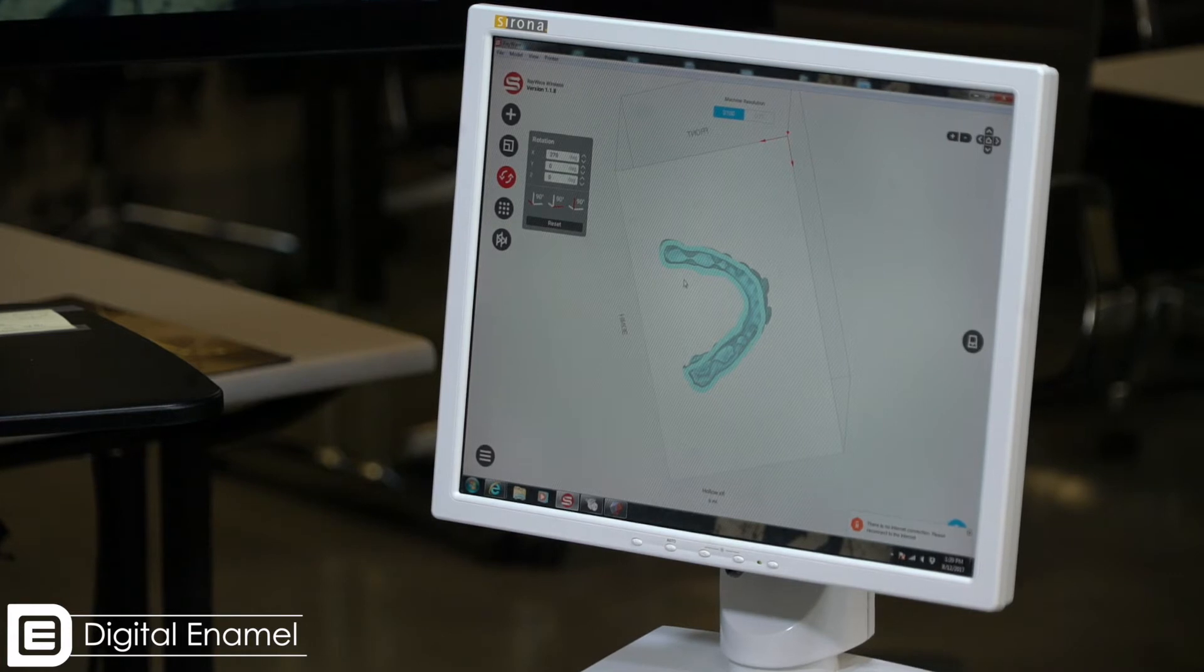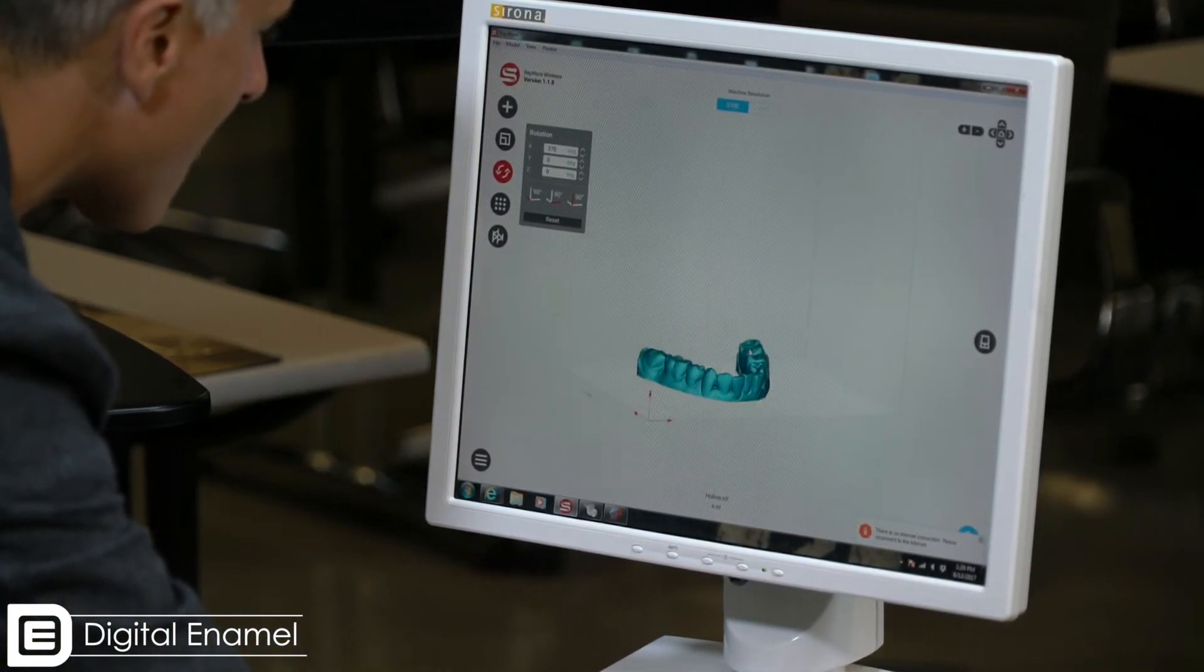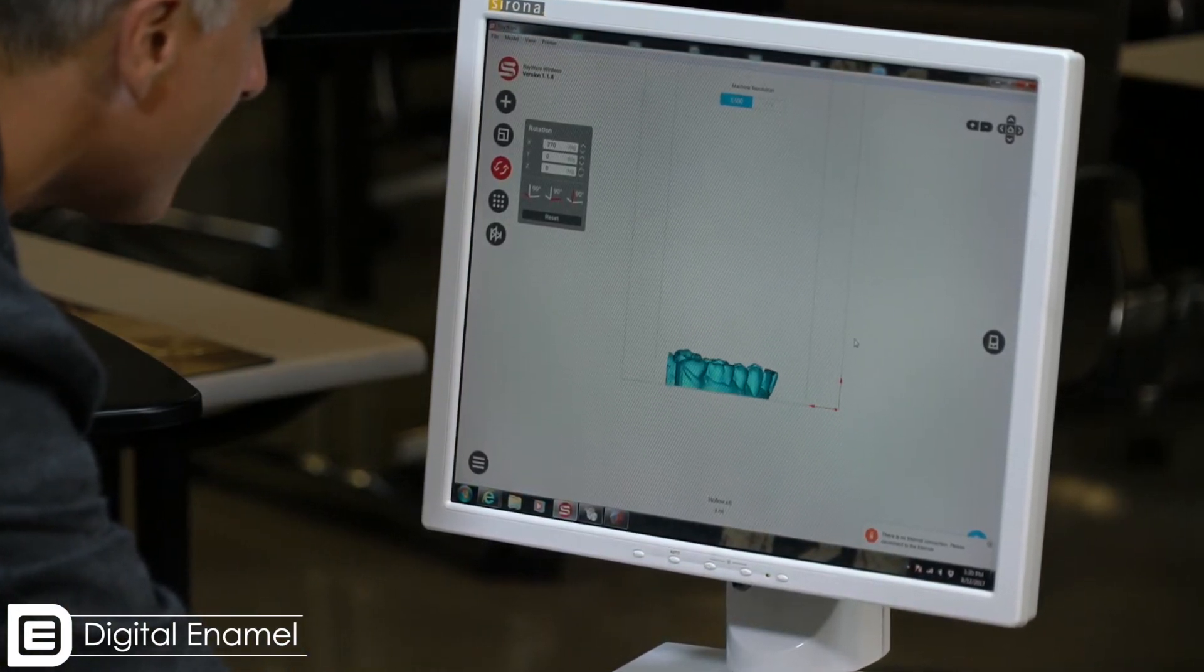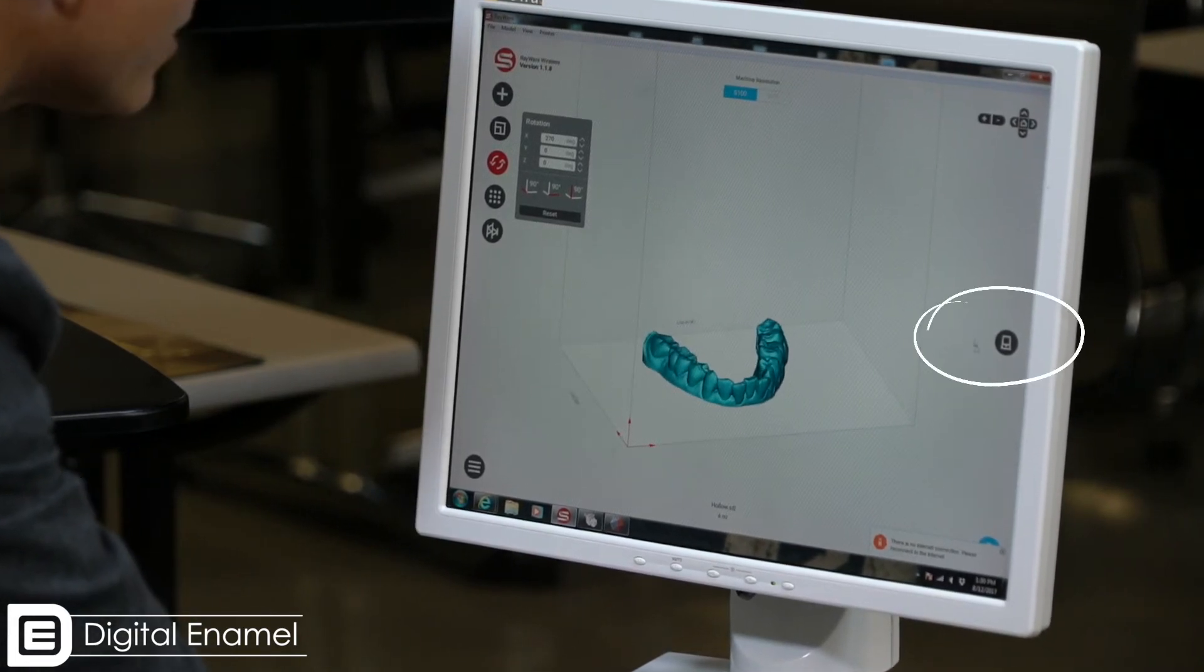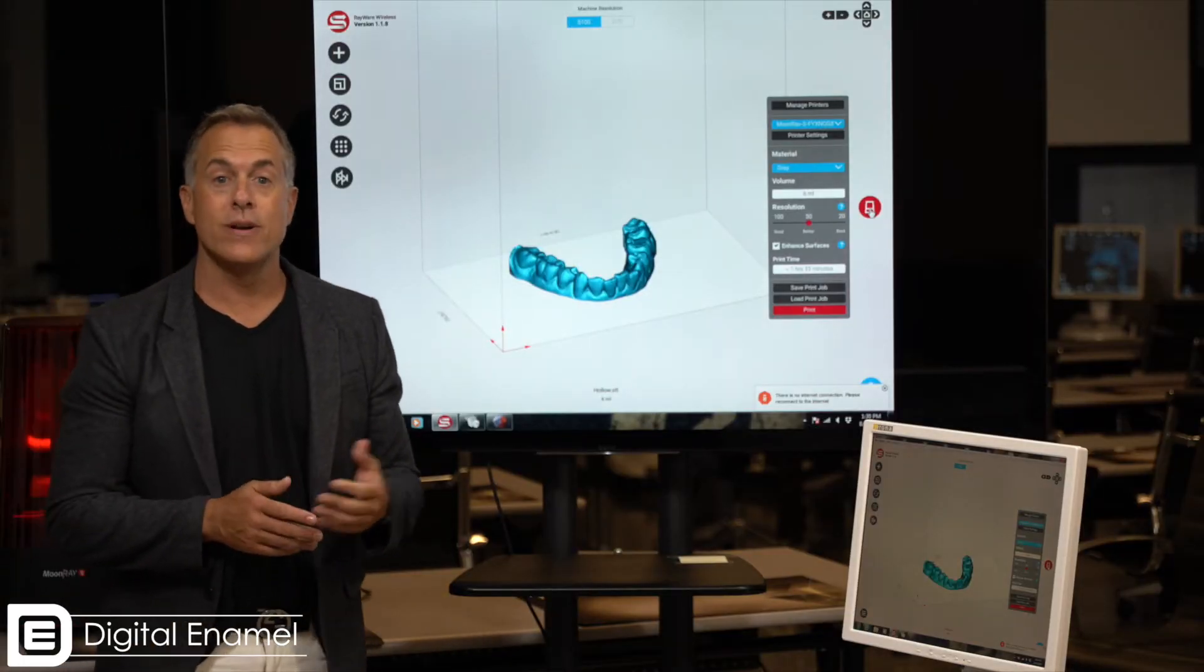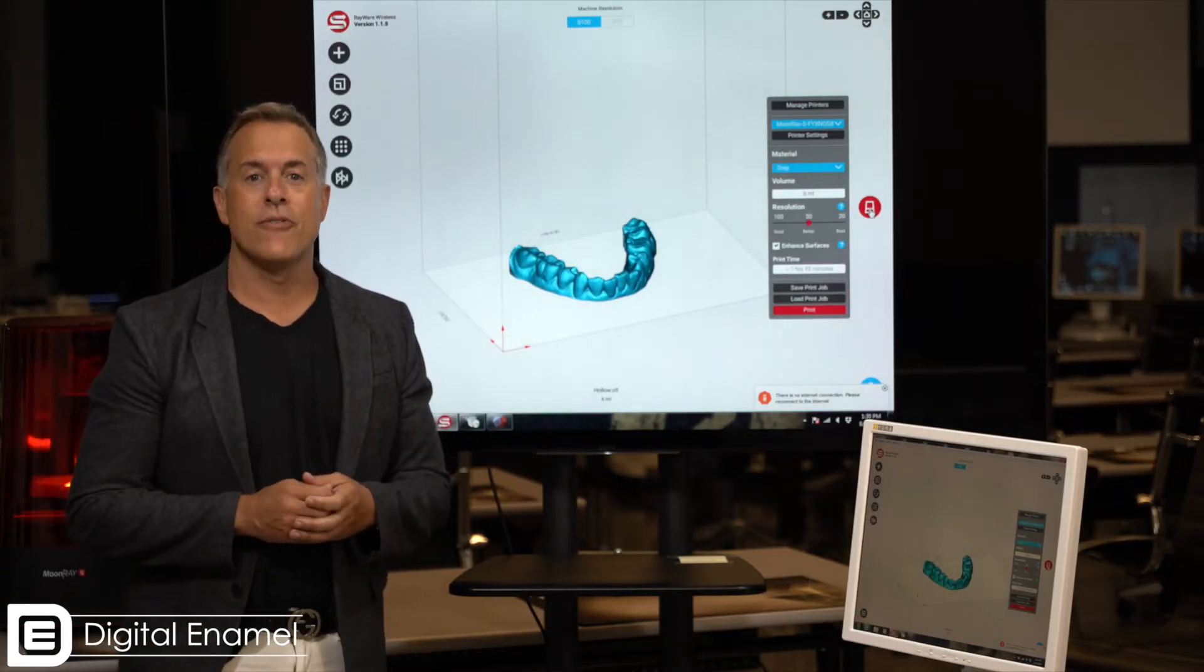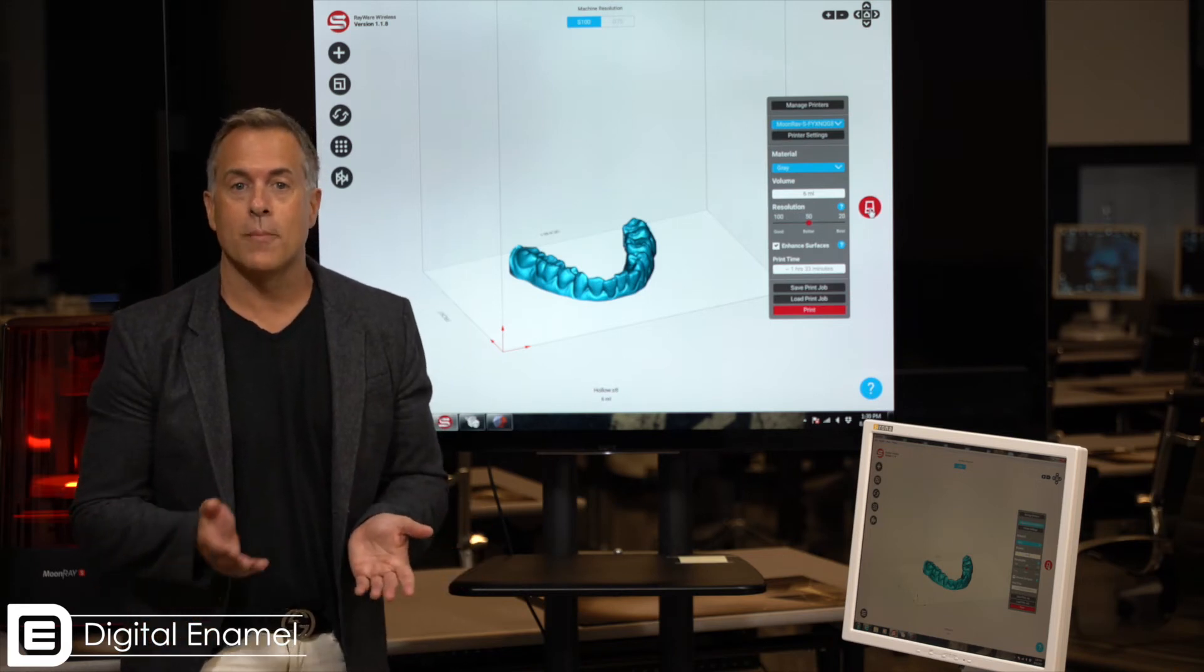So we're now ready to go ahead and print. We can just rotate that around, we can look at it from the side and it looks really good. When we click this little printer icon, we've got a couple of different choices of resin. This is no different than the mill preview in CEREC where we can select which kind of block we want to use or which burs we want to use.